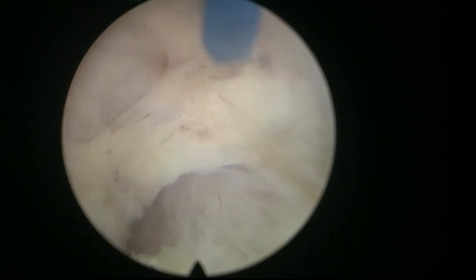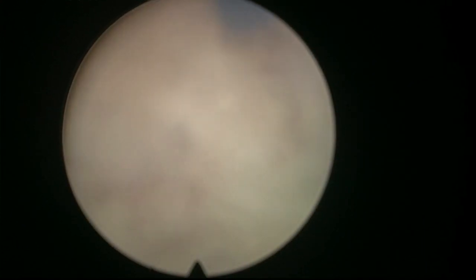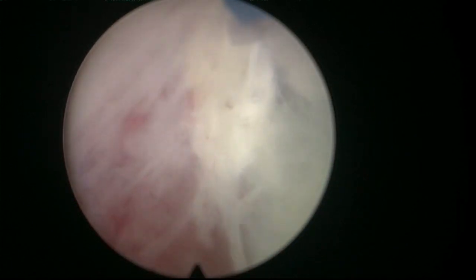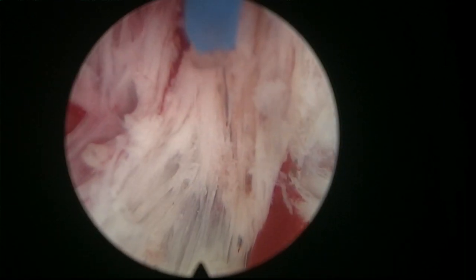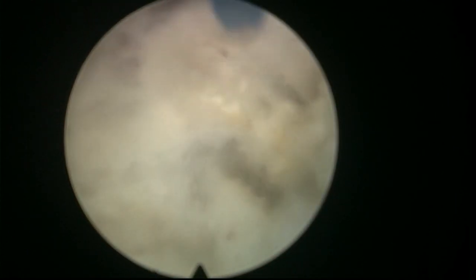Well, there we are. Trying to come up. That looks like adenoma. Trying to go from laterally around the apex. But here, if you come out to see, it's clear that we have to cut again a little bit on the prostate horizontally below the sphincter to get to the, let's say, 12 o'clock fibers here. So this way we leave the sphincter behind us.